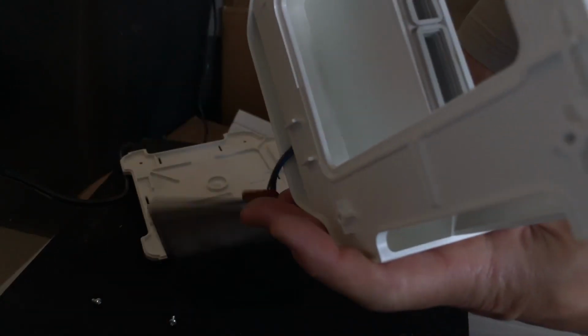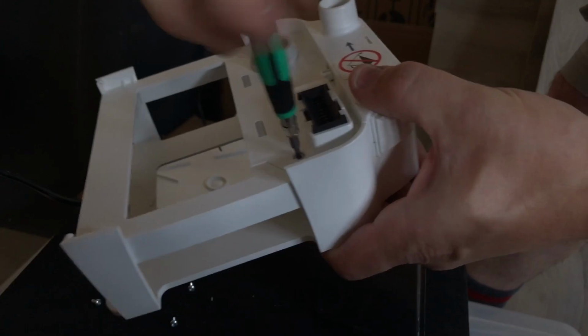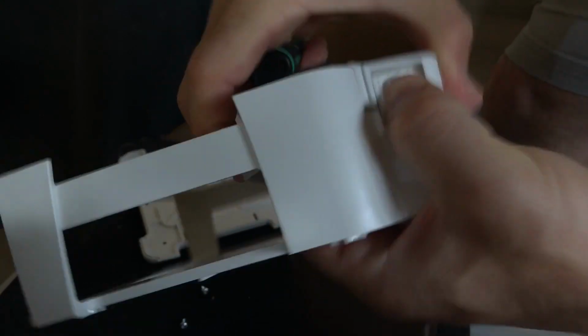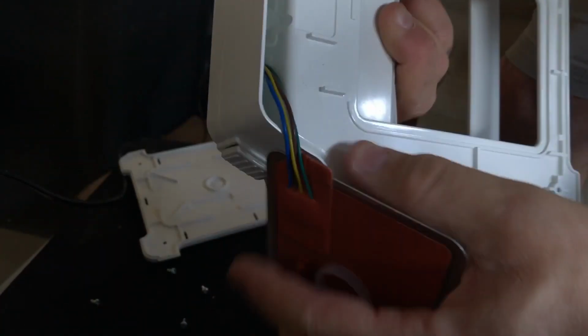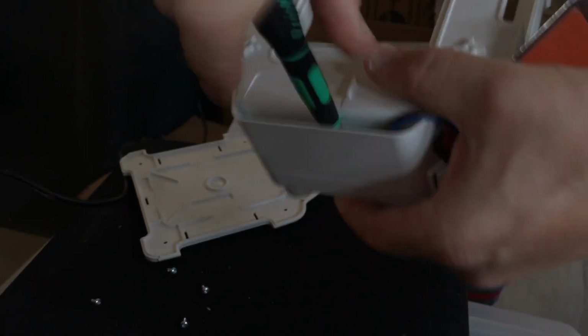Okay, I think this should come out. No. Okay, try again. Here and here. Nope. Oh, there's another screw here. There.